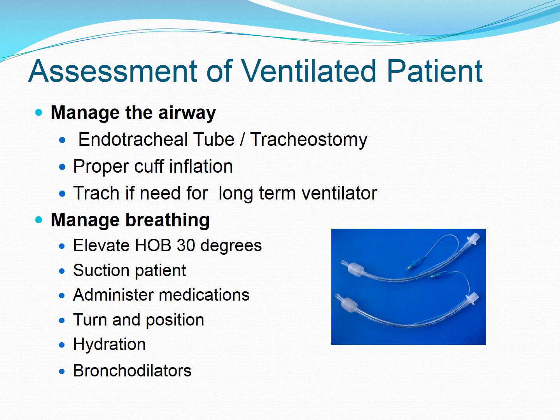The patient on a ventilator can be given medications. They can be given bronchodilators. Respiratory therapy can do this, and those bronchodilators help to open up the airway and facilitate O2, CO2 exchange. And when we open up those airways, it makes it easier for us to remove secretions.